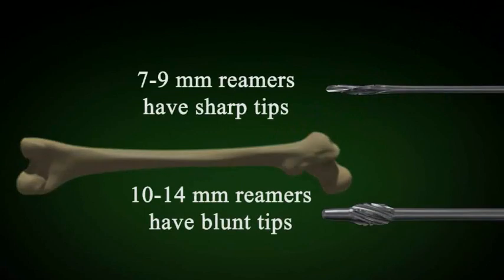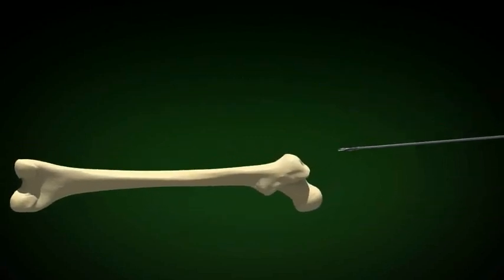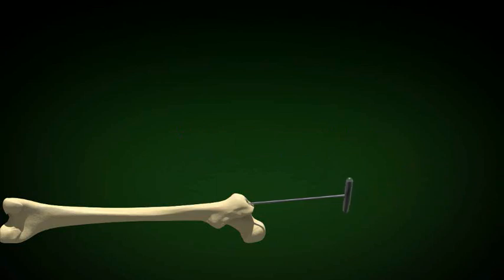There are pointed reamers and blunt reamers. The smaller reamers are pointed so they can penetrate from the metaphysis to the canal of the femur. Rotate the reamer in a clockwise direction when inserting and when removing the reamer. Do not oscillate the reamer.